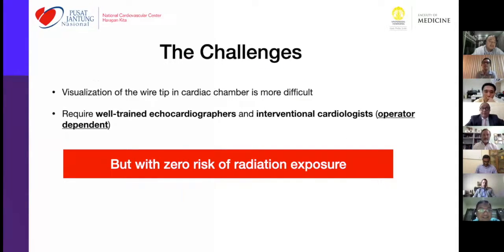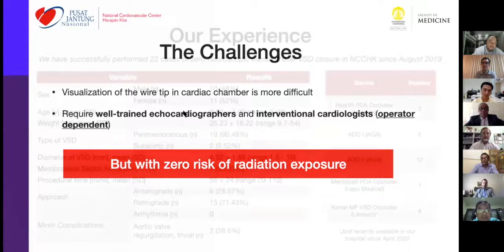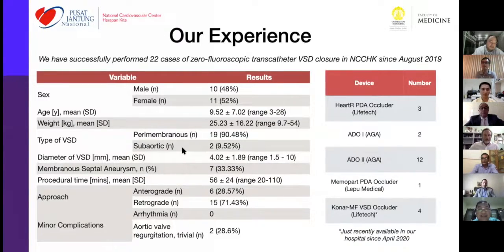The challenge is that visualization of the wire tip in the cardiac chamber is quite difficult. It requires a well-trained echocardiographer and interventional cardiologist, and it is operator dependent, but with zero risk of radiation exposure. This is the characteristic of our patients.